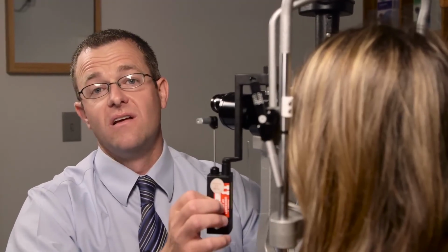So as a general rule, you're going to start with the right eye first and then do the left eye. And you look at the eyelids, and then you look at the conjunctiva, and then the cornea, and then the anterior chamber, and then the iris, and then the lens, and then you go back to the fun part of the exam, the retina exam. So make sure you concentrate on those first initial things. But as a retina specialist, I look at those areas to make sure they look okay, and then I'm really thinking about getting back to where the fun starts, which is behind the iris.